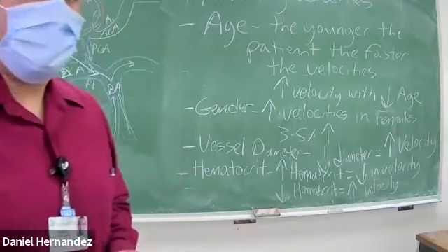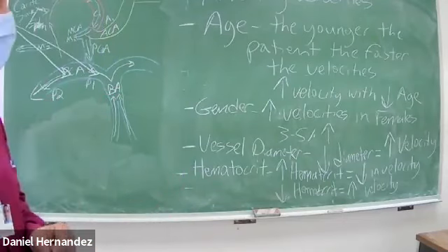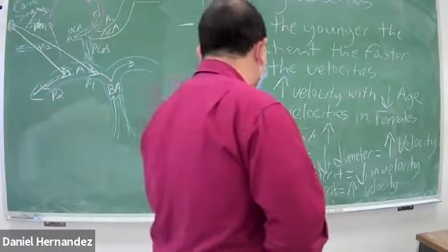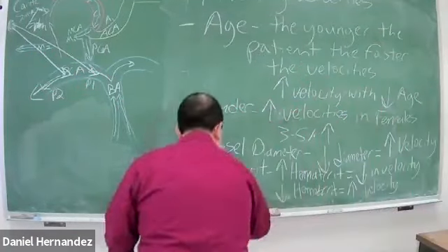So this is part of the reason why we do this exam for patients with sickle cell. Sickle cell patients will have a low hematocrit.